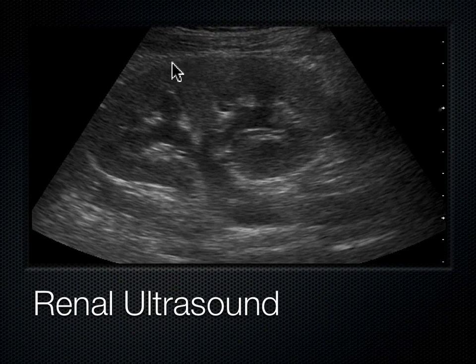And so when somebody has a blockage of the kidney, like a kidney stone, there's really nowhere for the kidney to go to expand. And so that's why people get excruciating colicky pain with kidney stones. It's because of this capsule, this thick structure out here.